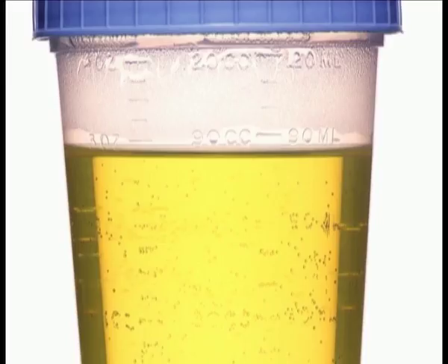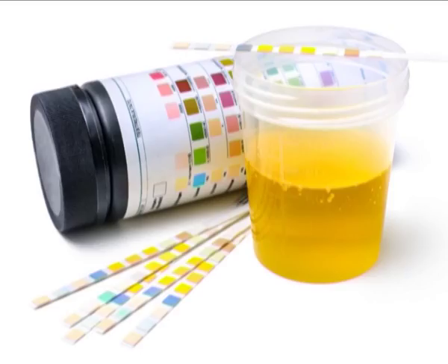The target parameters that can be measured or quantified in urinalysis include naked eye examination, that is, examination for color and smell, plus analysis for many substances and cells, as well as other properties such as specific gravity. A part of urinalysis can be performed by using urine test strips, in which the test results can be read as color changes. Another method is the light microscopy of urine samples.